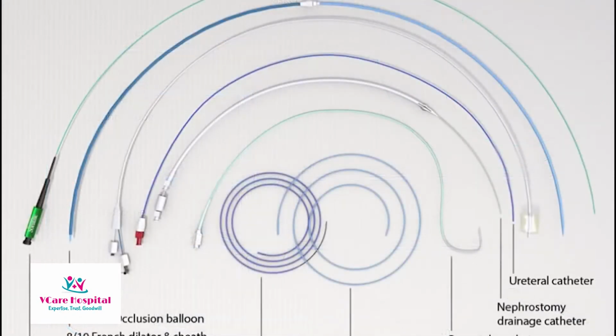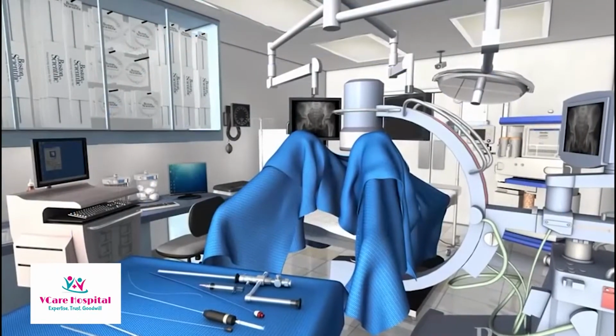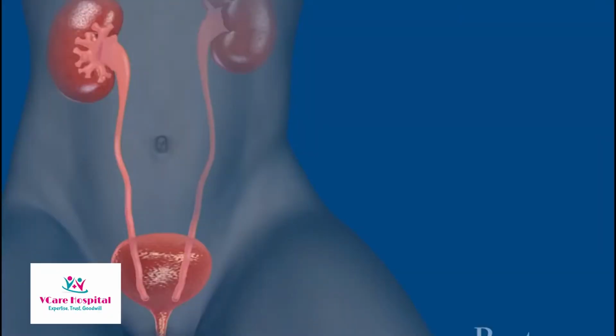This video will demonstrate the steps of a percutaneous nephrolithotomy. This patient has a large stone in her kidney. Insert the cystoscope.